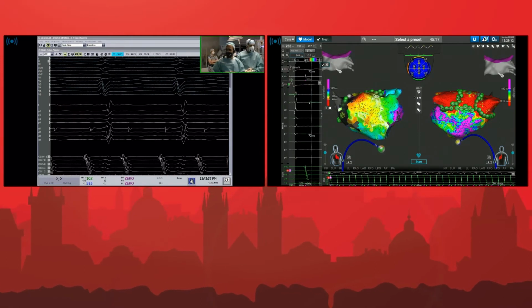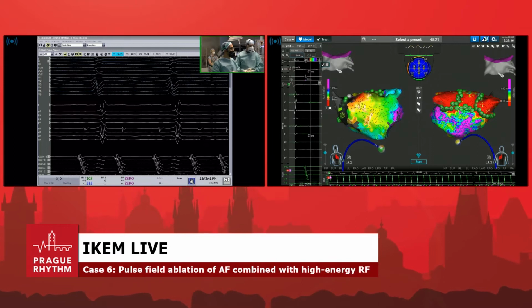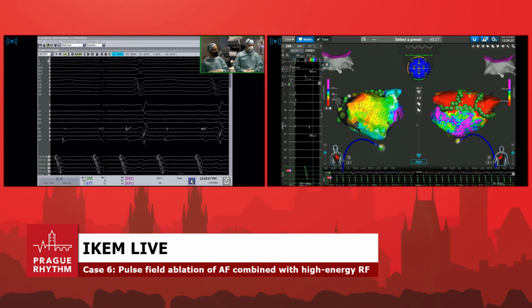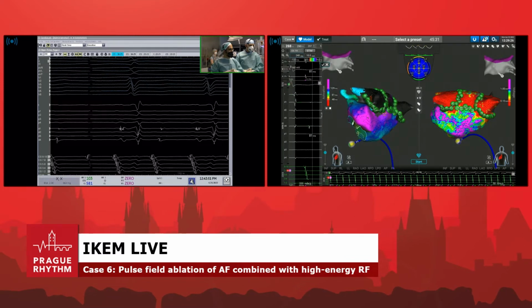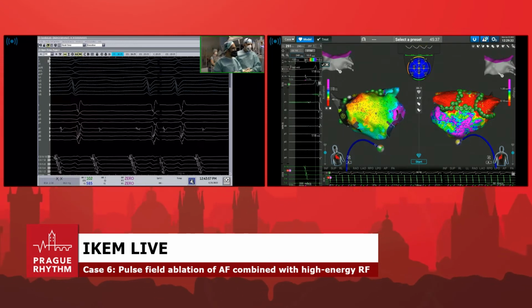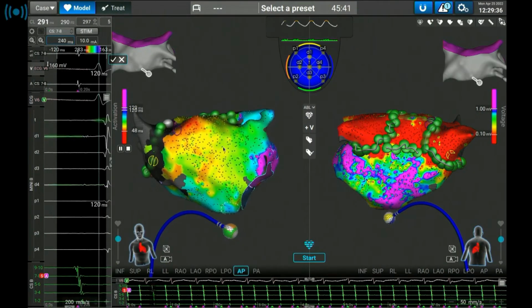Okay, so you can see the focal exit from the right septum, right roof septum, and we can rotate all the way, and you see that it collides on both sides of the mitral annulus, so that suggests that the tachycardia is not left atrial, it's exiting into the left atrium from the right atrium.